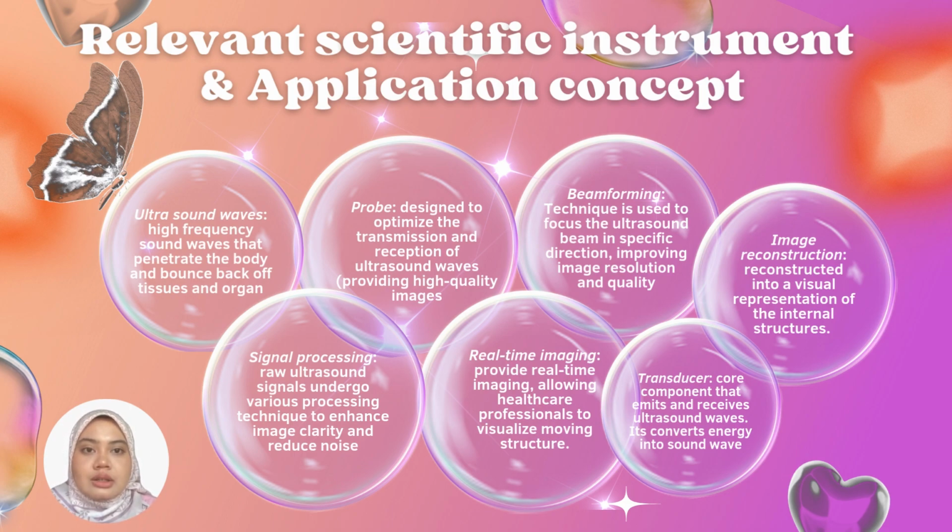The last one, real-time imaging. Diagnostic ultrasound scanners provide real-time imaging, allowing healthcare professionals to visualize moving structures like blood flow, heart valves, and fetal development. This real-time feedback is crucial for guiding intervention and monitoring procedures.